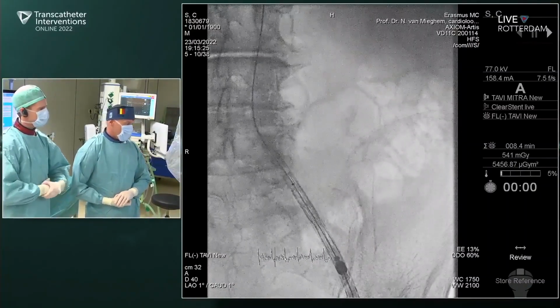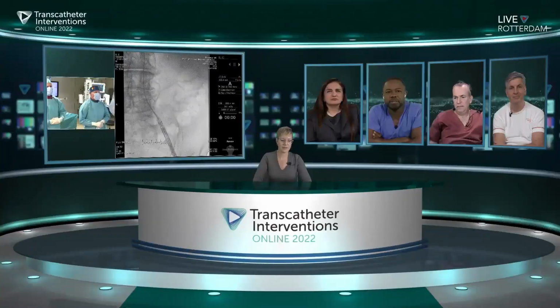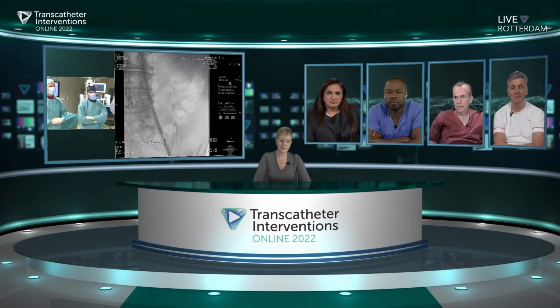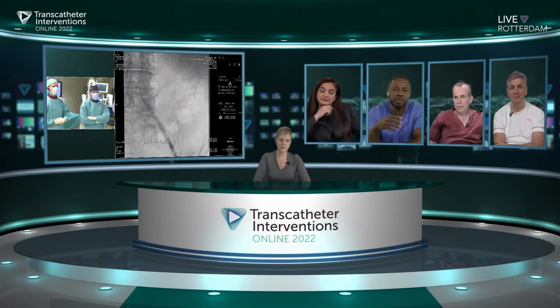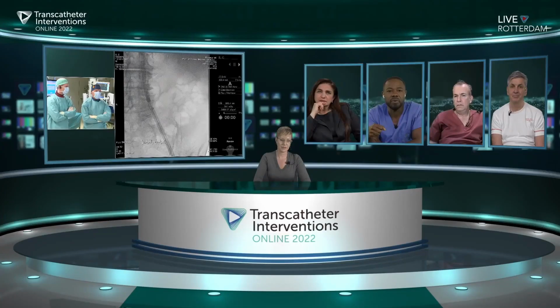So maybe, if you agree, a question for you, Nicolas. Just about the, because this is a really contemporary practice, we know that devices are going to seal. We're going to get no regurgitation in the vast majority of the cases. But we discussed during the previous symposium about the commissural alignment. What do you reckon for the Navitor in terms of handling the delivery catheter to get a proper commissural alignment?